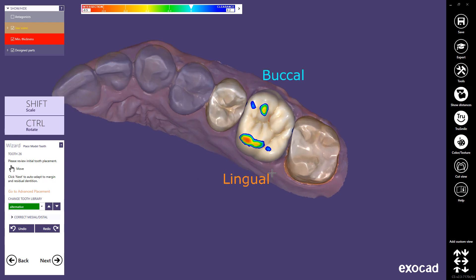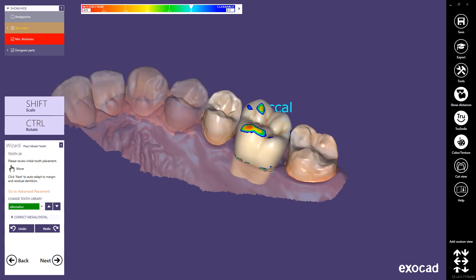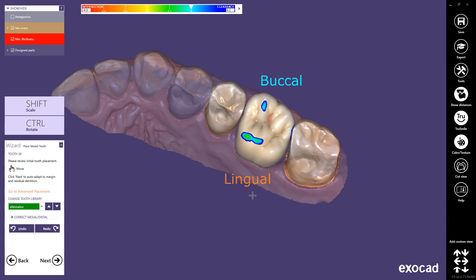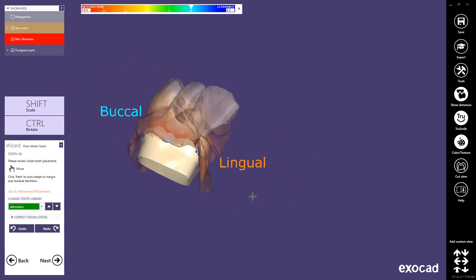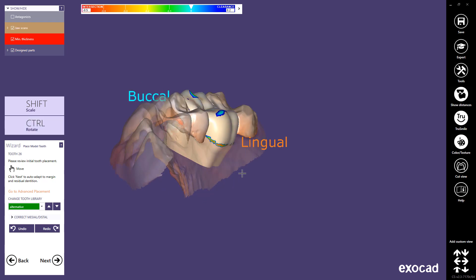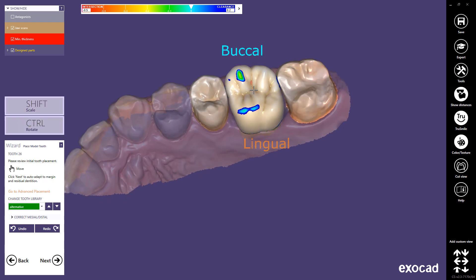You can correct the suggested tooth placement by dragging the model tooth with your mouse. Useful shortcuts are available for tooth placement: hold Shift to scale the tooth, hold Ctrl to rotate it, and hold Ctrl and Shift to perform direction-based scaling. Click the Next button to proceed.